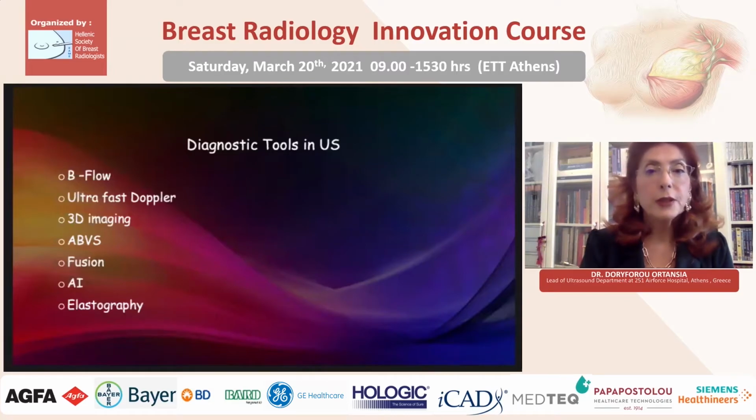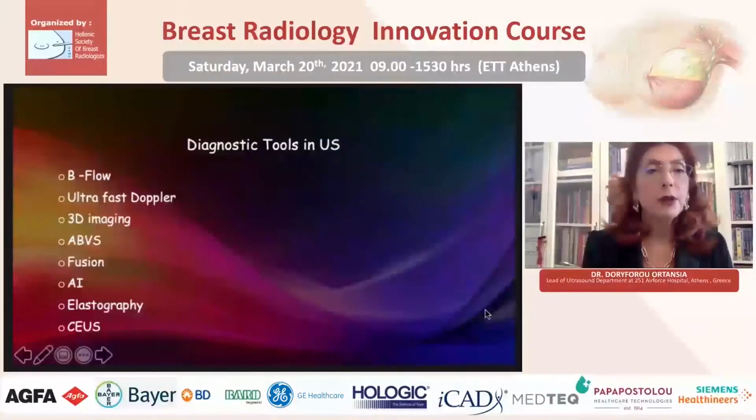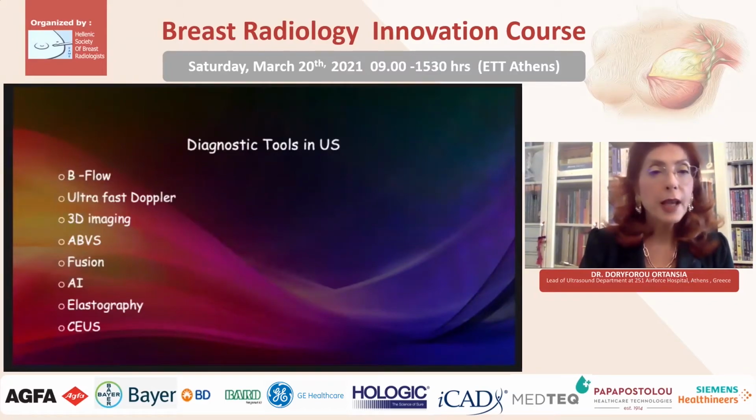And even more recently, the use of contrast-enhanced ultrasound in breast assessment, not only breast assessment, but also in detection of sentinel node. So please allow me to focus on the last two because of my previous experience in the UK. Both methods, just to let you know, are very operator dependent and therefore an experienced operator is needed.